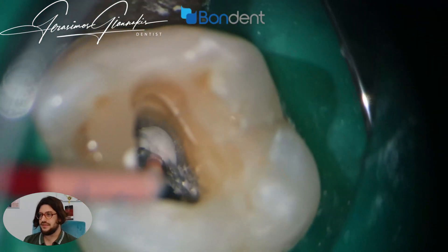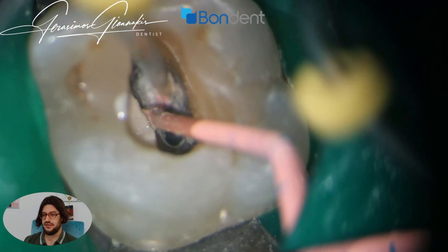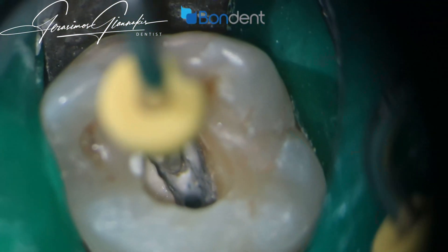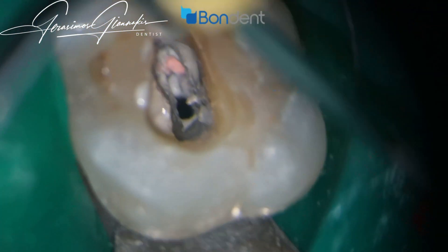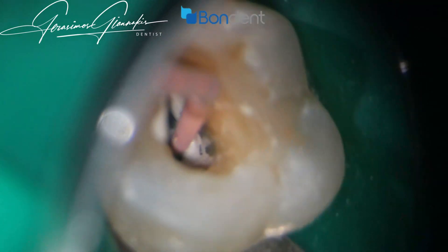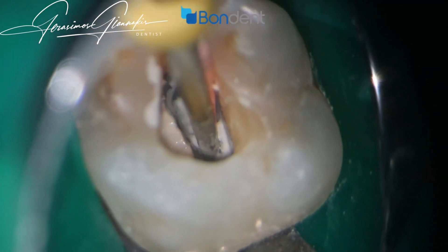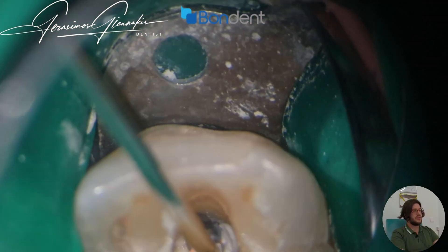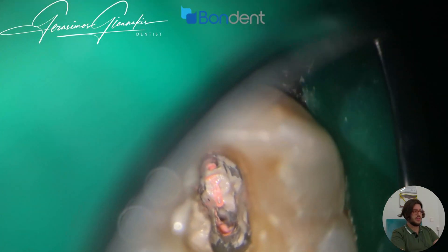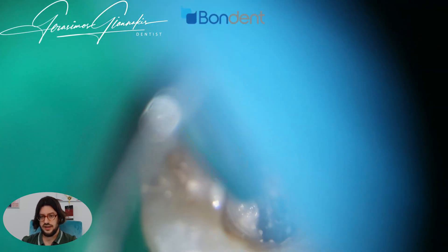For this step it is very, very helpful to have magnification, depending also on how deep the split is. Now I will use the filler device to completely fill the canals with plasticized gutta-percha, and of course use a plugger to tightly adapt it into the canal system.